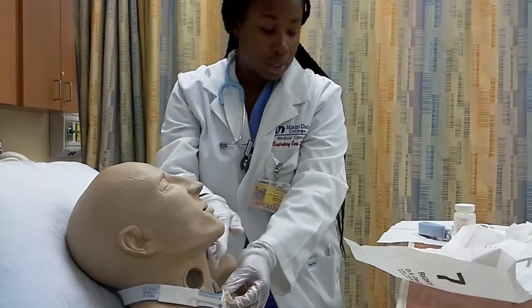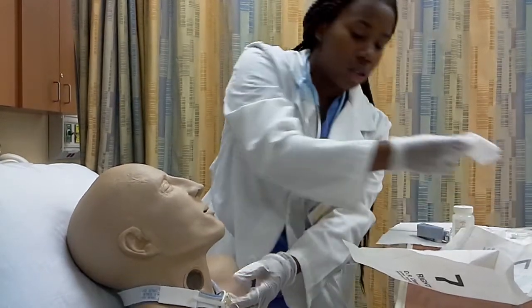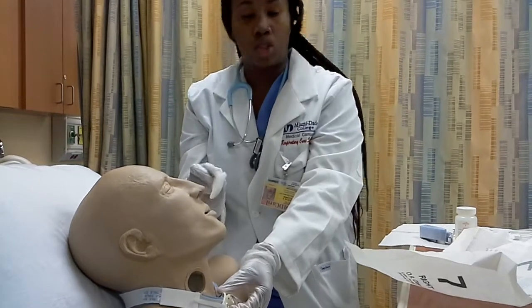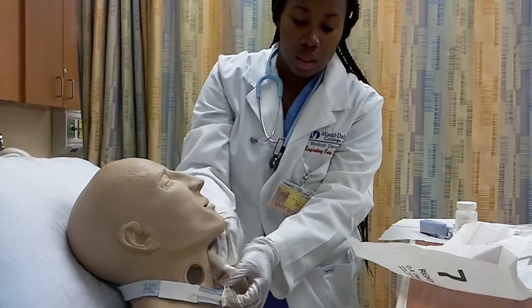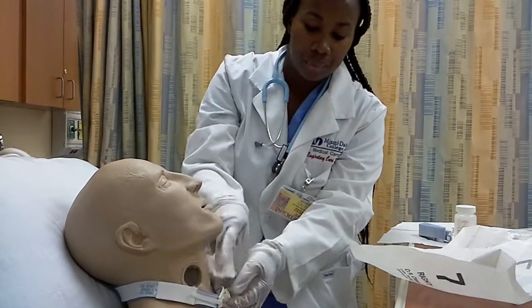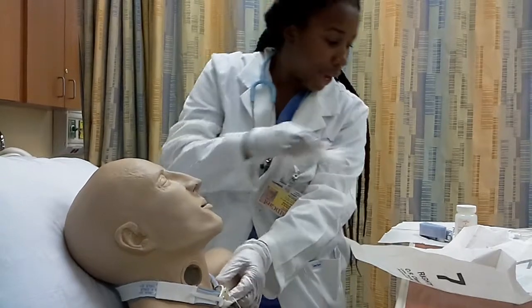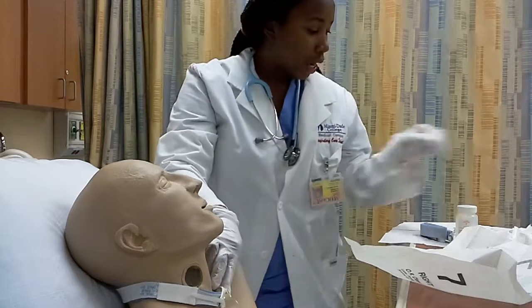So after I have rinsed the area, I'm going to go ahead and get another sterile gauze, and I'm going to go ahead and dry the area. Always want to dry your area because you don't want to leave it wet. That can also cause skin breakdown. So since I have dried it, and I dried under it, I'm going to go ahead and insert his inner cannula back in.